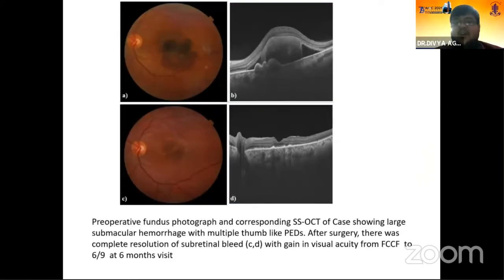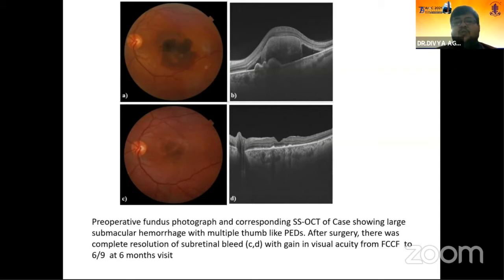Tamponade was given using SF6. In normal practice, if we give intravitreal C3F8 or intravitreal gas with rtPA, we sometimes have to give prone position to the patient to displace the bleed. But here, since the bleed is already displaced, the patient is free to use propped-up position, which will also help in clearing of the blood.